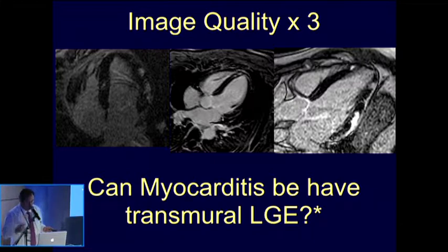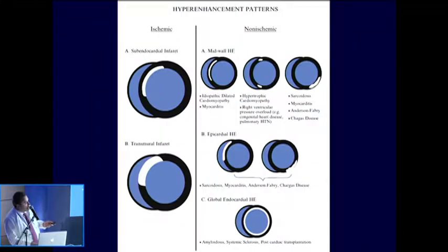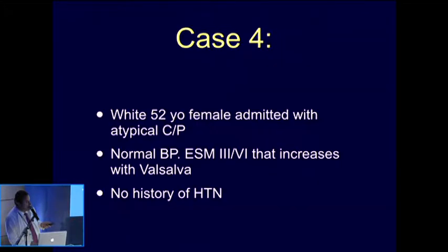A key question. One of our fellows gave a lecture prior to mine, because myocarditis can be transmural. One of the cases that Carlos Tapia will show later is that myocarditis can be transmural, and that's very important because according to the book I showed you initially, myocarditis is classified as mesocardic or subepicardic, but there are specific cases, particularly giant cells myocarditis, where late enhancement might have a larger extension. Therefore, not all patients follow the necessary patterns of late enhancement.